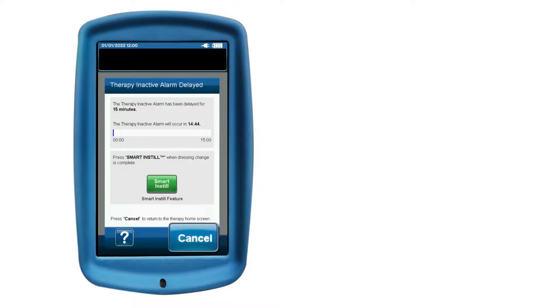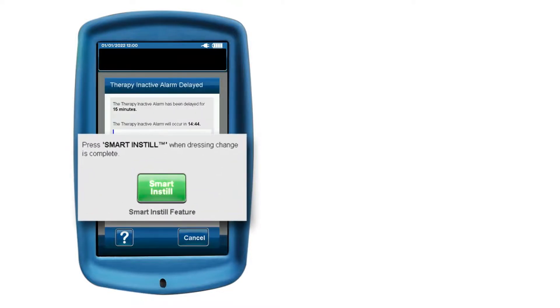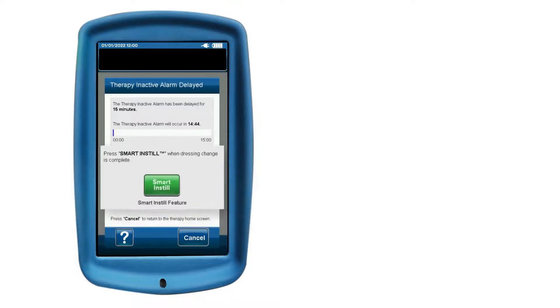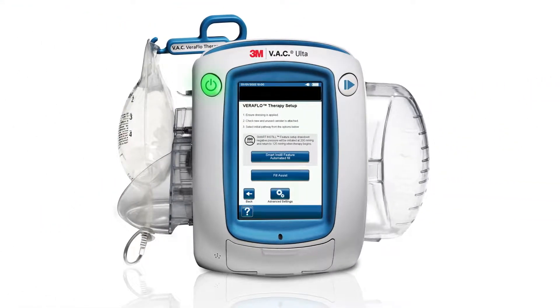Select Cancel to return to the home screen and continue to use the previous Smart Instill settings. If you want to reassess the wound and apply new settings, press the green button to return to Smart Instill and replace the canister to perform a new assessment with the Smart Instill feature.